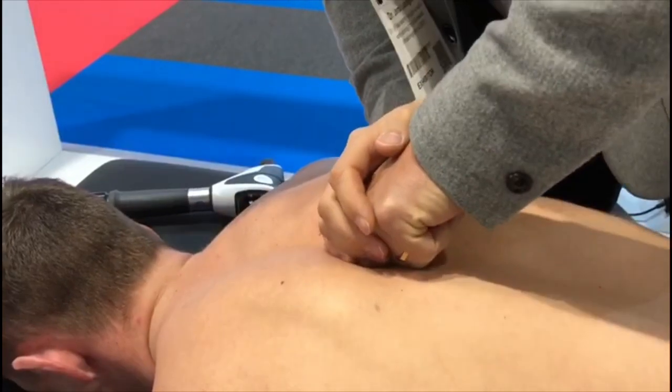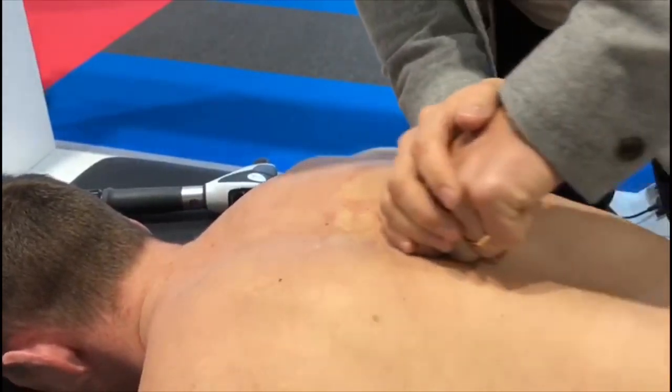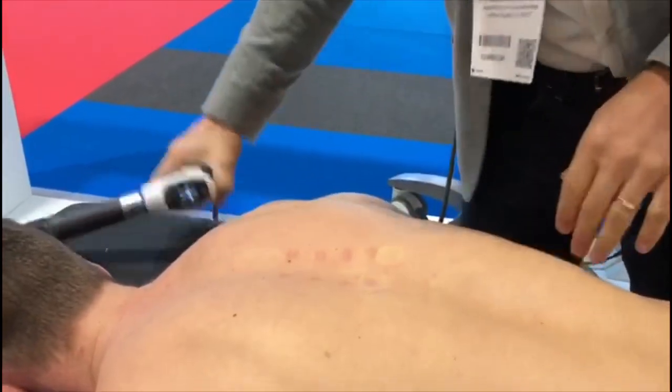There's actually quite a right movement. This is a bit stuck, and this region as well, I would say. Is it related to any pain when I do that? No, good. All right.